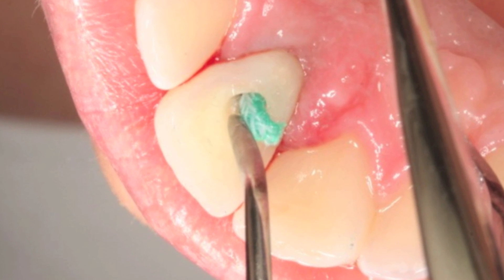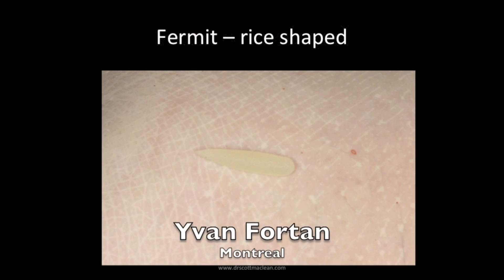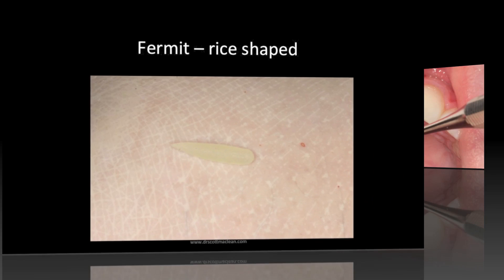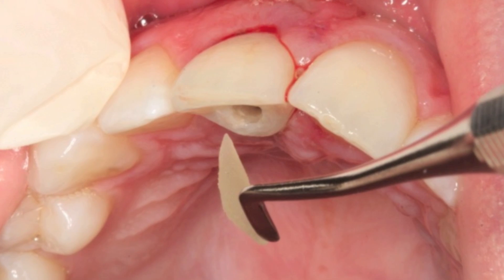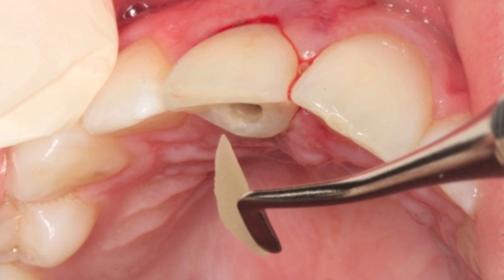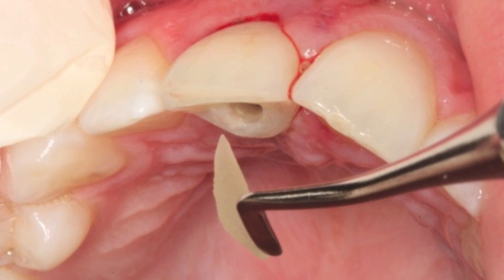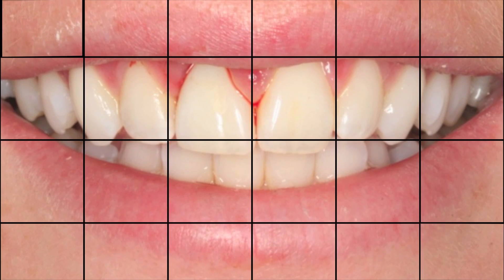This tip is from my Canadian friend Yvon Fortin. He says to roll a little bit of Fermit into a rice shape on the back of your glove, and you can carry it to the mouth — this makes it easy to go down the access channel. Once you place your cord, you can go back in and place this little piece of Fermit to seal the area off so bacteria can't go down there.